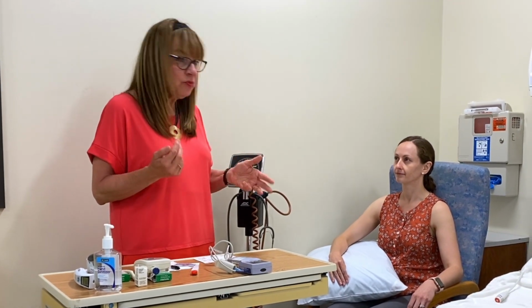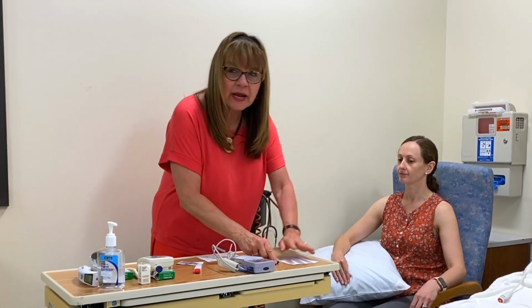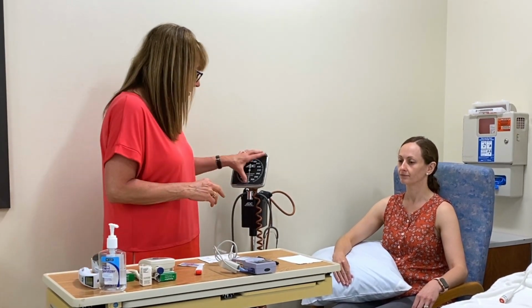So what I'm going to do first, and what you're going to do in the laboratory, because remember, vital sign competency is tested. And in order to be accurate with your vital signs, you need to make sure that your pulse is within 2 beats of the faculty member, up or down. The respiratory rate needs to be 2 respirations, up or down. And the blood pressure needs to be within 4 millimeters of mercury. That's for the systolic and the diastolic, up or down. So what we have students do is they're going to write down, when you're being tested, your vitals. We write ours down, and then we compare after the fact.